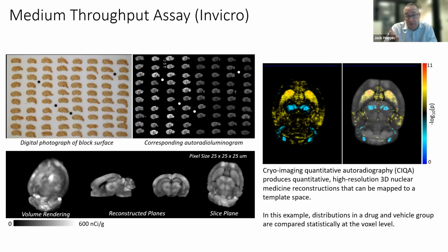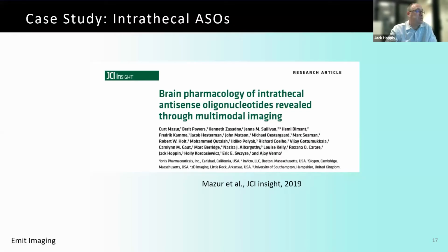You can get a whole cohort, you can get a whole study in one block. And as you see here, this is actually a very well powered study. I think that really speaks to the future of the modality. And very nice data processing there. That should give the IA team from Invicro a shout out. You're looking at voxel-wise comparisons across all cohorts in a common co-registered space.